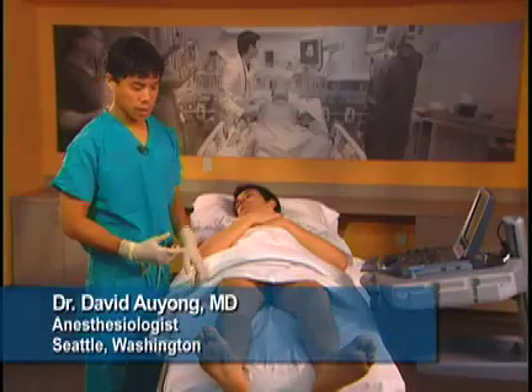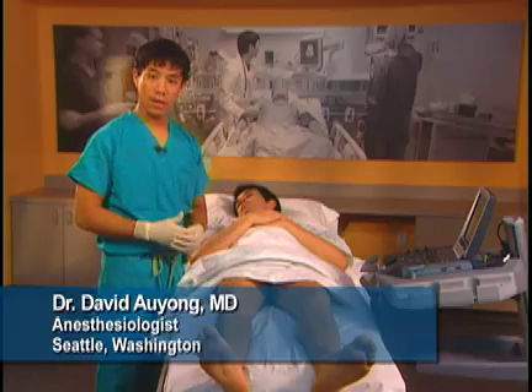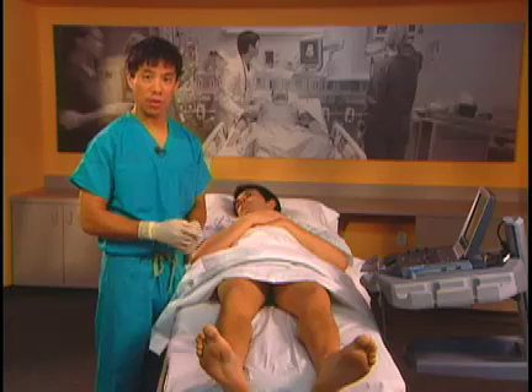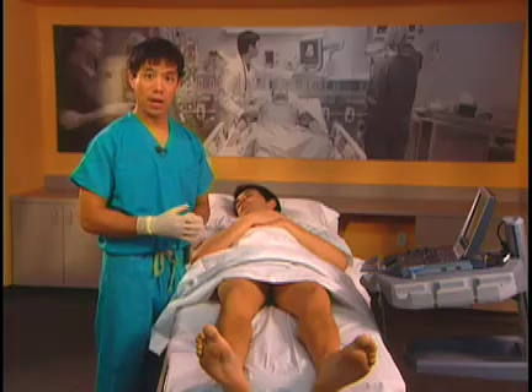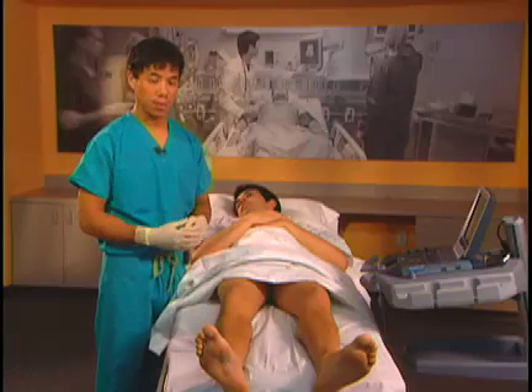The Saphenous Nerve Block is useful for medial knee surgery, medial leg surgery, and medial ankle and foot surgery. The Saphenous Nerve is a continuation of the femoral nerve below the knee. This is a good block to do in conjunction with a popliteal sciatic nerve block to give you complete anesthesia below the knee.